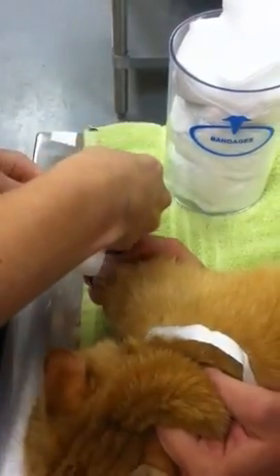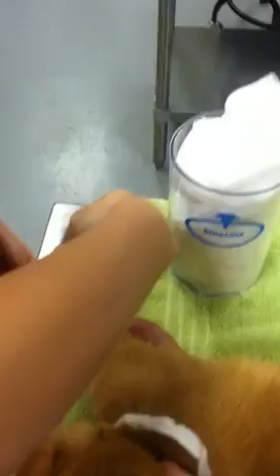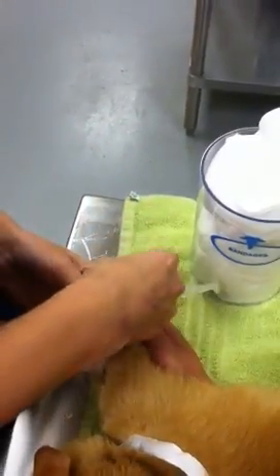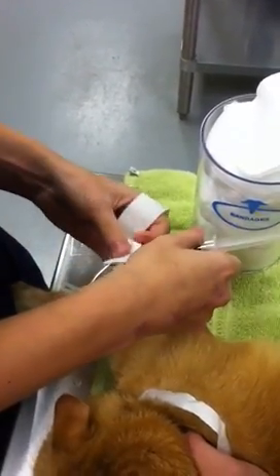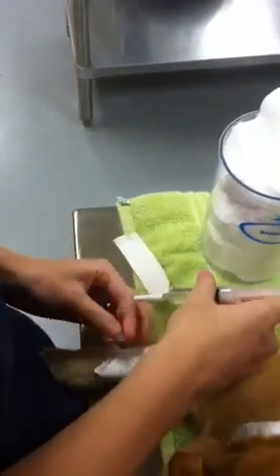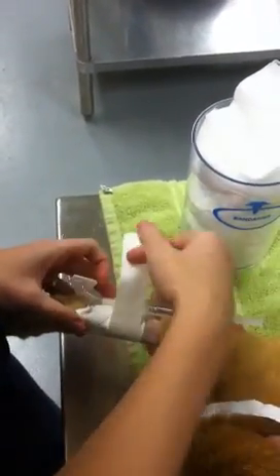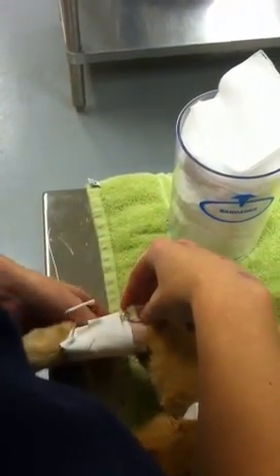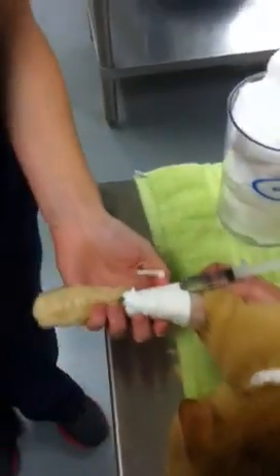I'm going to close this off and then anchor my flush side here, just taking a little bite out of here to hold it down and then anchoring it to the leg of the cat. Being sure that it could also be changed and not completely covering its entry point — and that would be a cephalic catheter.